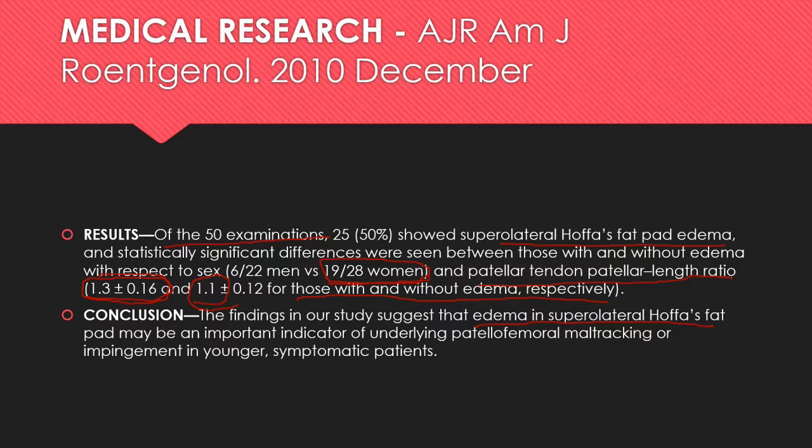Impingement of Hoffa's fat pad is a pain-generating condition that shows up as an edematous fat pad on MRI studies. So this indicates that this examinee's particular pain symptoms seem to be associated with a pre-existing condition of patella alta.